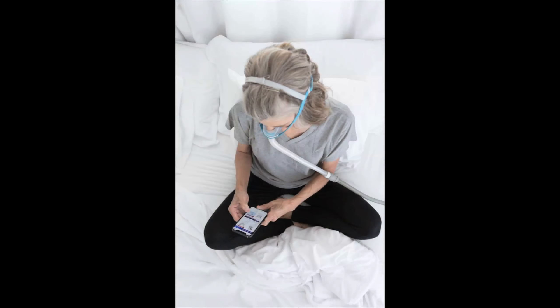The second tip is to be comfortable with your mask. Make sure that you learn how to put it on and off, and you can try that by using the CPAP mask during the day when you're not sleeping. Really learn and get acquainted with your mask.